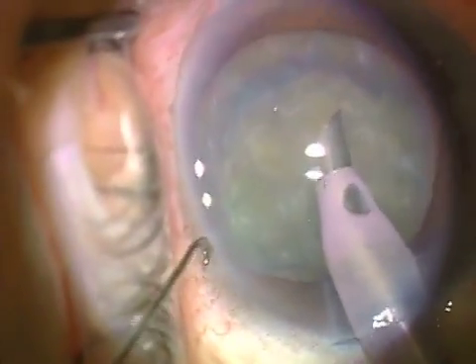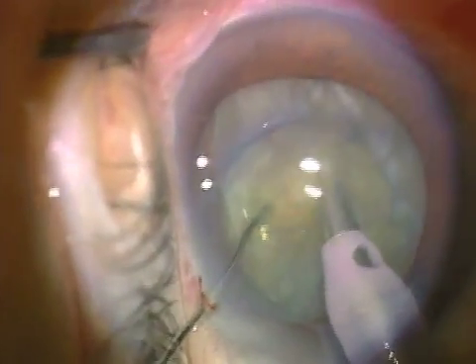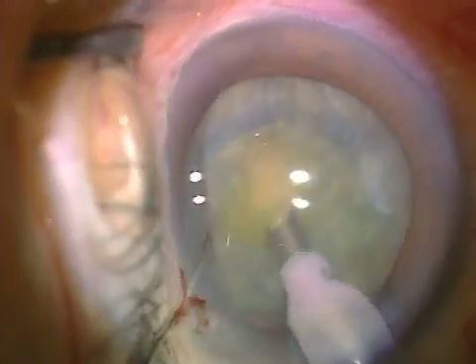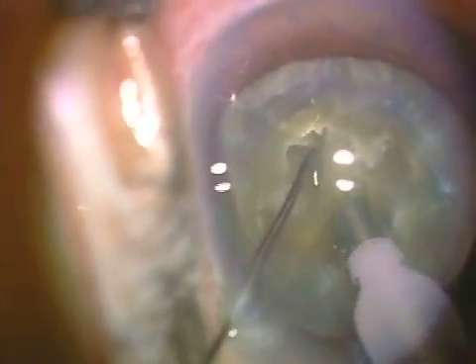This is a Hefliger cleaver, which is my preferred chopper. In a very dense lens, it could be longer at the tip for more complete fracturing, but this works and is my preferred configuration for the average nucleus.